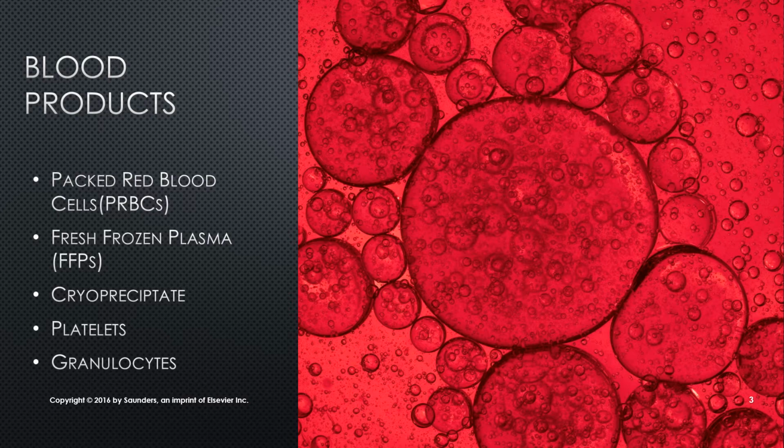Always infuse blood products with normal saline. It cannot be infused with anything else. Blood products have to be initiated within 30 minutes of retrieving from the blood bank in the lab. Each blood container is going to have a label that identifies the product, the expiration date, and the blood type with the Rh factor. In addition, it will have a blood bank label that identifies the product after type and crossmatch is completed with the specific client. Sometimes we call this a tag.